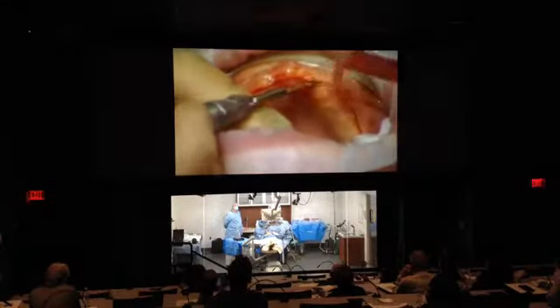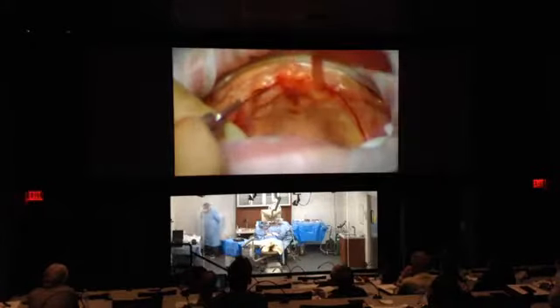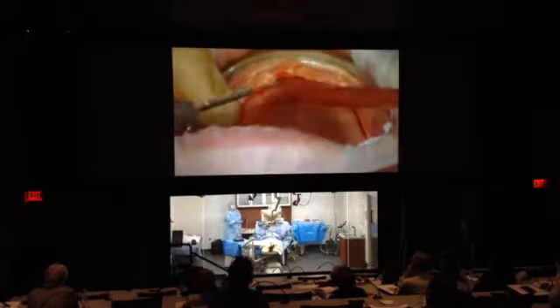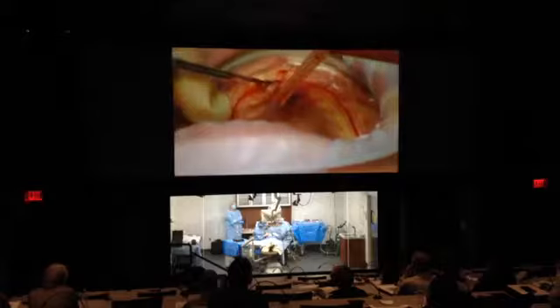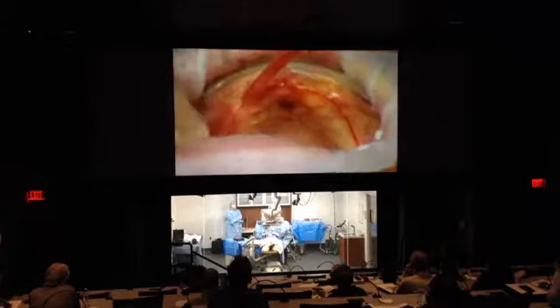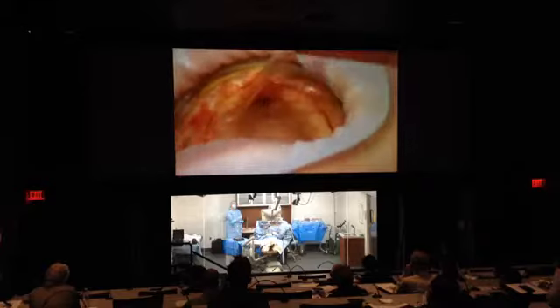You see here this incisive papilla, it's quite thick here in the middle. This I'm going to trim down. Oftentimes this interferes with the fabrication of the final prosthesis. We have to thin that out in that spot. And what I hear from my restorative colleagues, typically they do not like to see this right here. They want me to take it down and reduce it. The flatter the ridge underneath the final prosthesis, the easier it is going to be for the patient to clean at home. Okay, so we're going to start with the posterior here and reflect the flap.